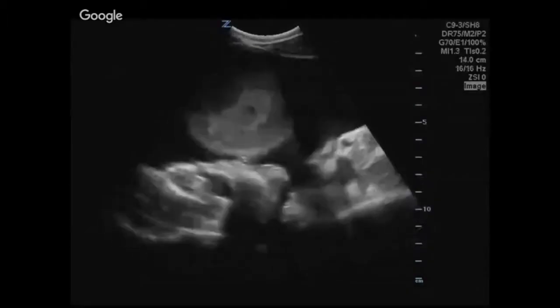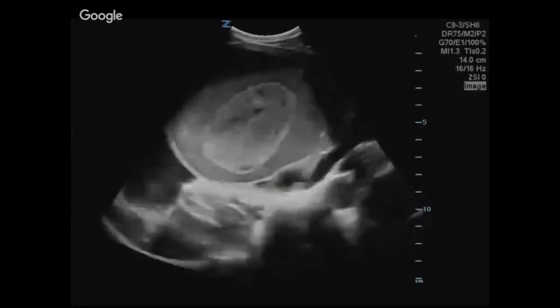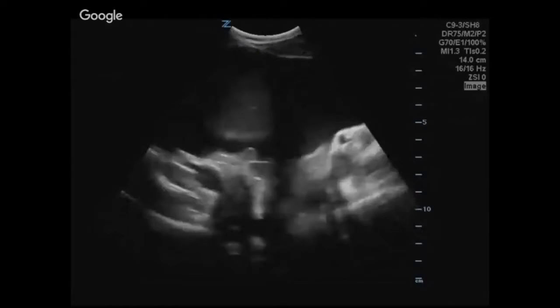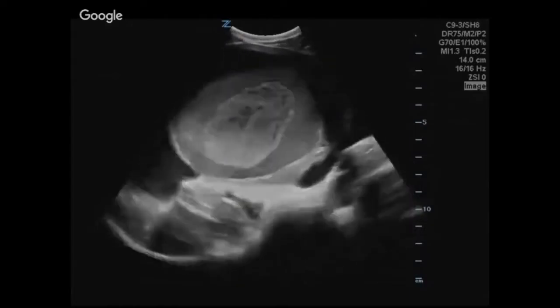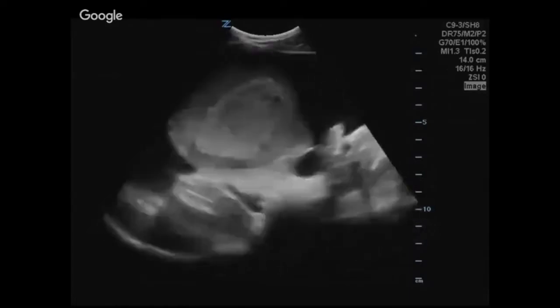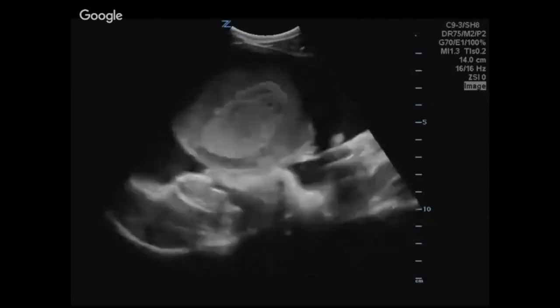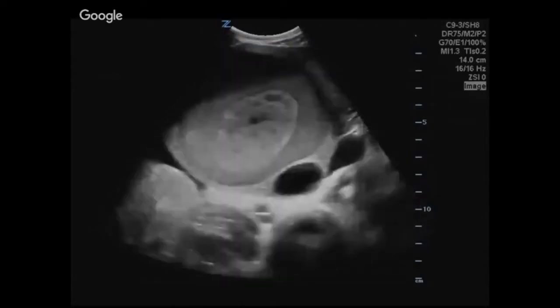And here, it's teratoma or something. I don't know. Ugly mass. Yeah, some kind of a cancer. So you're in the pelvic area. It's huge, and that is a complex ovarian mass. Yeah, it's huge. Probably, I don't know, teratoma possibly. You can see the teeth. Yeah, smile. I think I presented a teratoma last time. Where are the teeth?